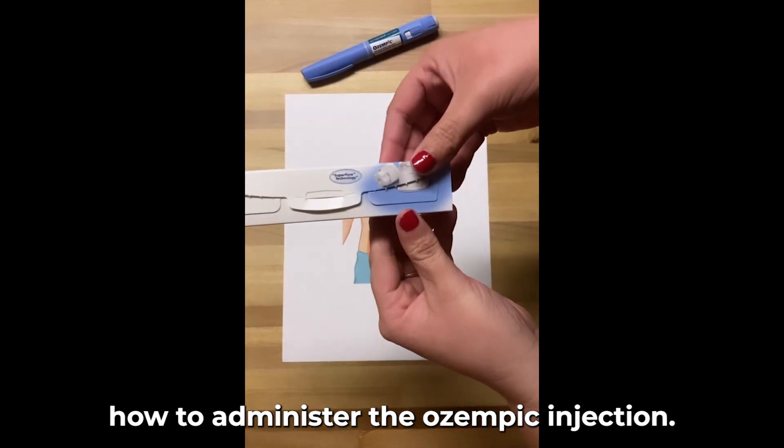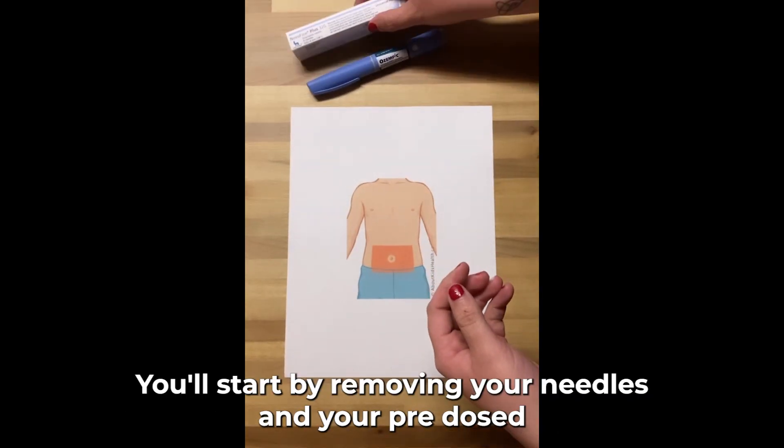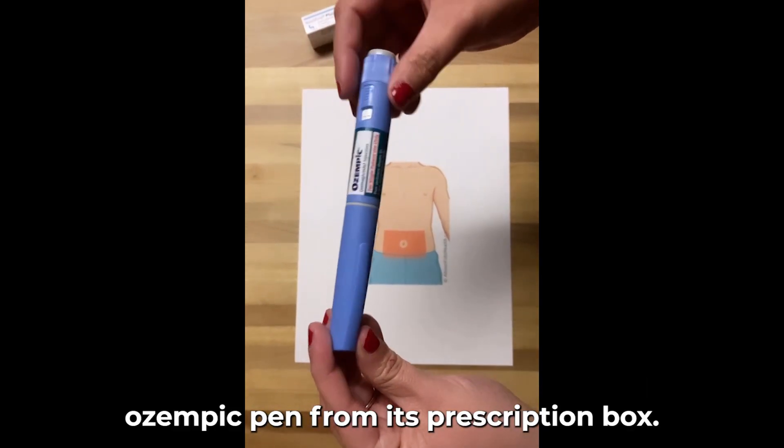Today I'm going to show you how to administer the Ozempic injection. You'll start by removing your needles and your pre-dosed Ozempic pen from its prescription box.